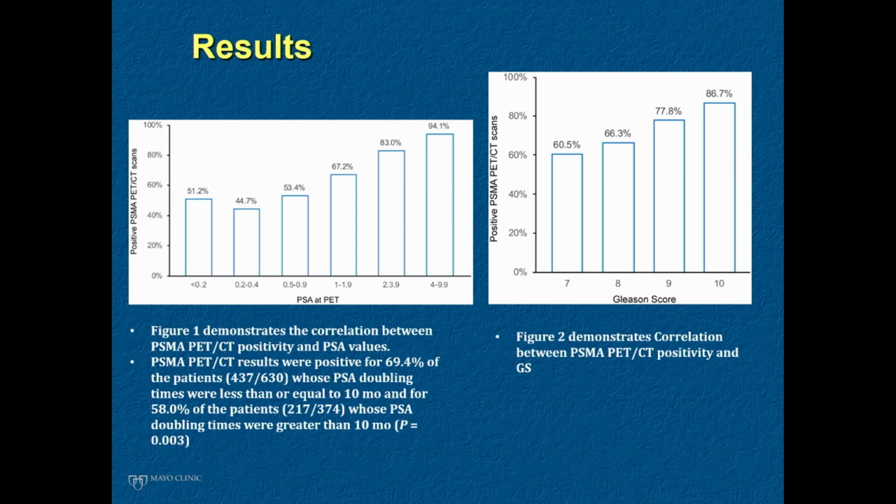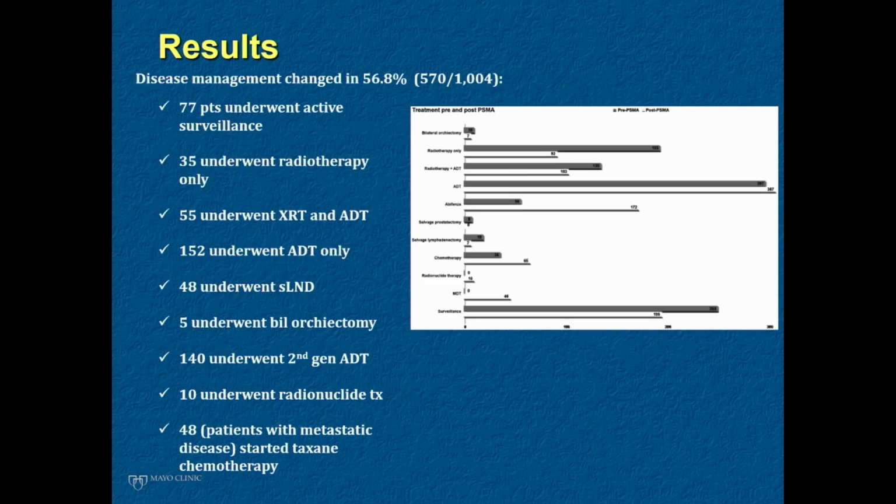That sweet spot, I think, is 0.5 or less when you're going to have at least 50% detection rate. And here, as you've also heard, Gleason score is also an independent feature related to the potential for a postoperative PSMA PET positive scan. And I put this in here because you can see here, hopefully rightly, but over 50% of the time in this particular series, the management of the recurrent disease changed based on the PET scan. So we've seen disease management change in the initial staging as well as the recurrent staging.